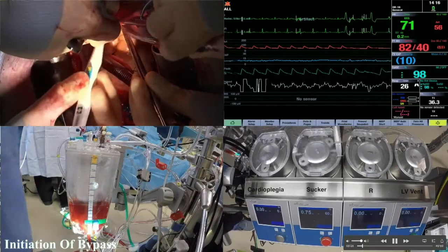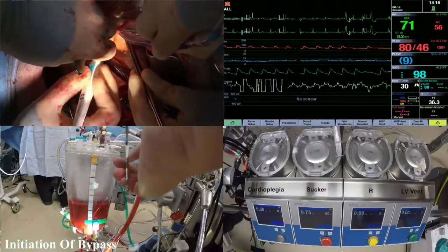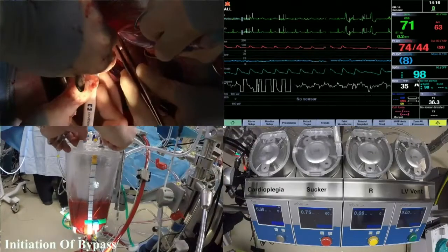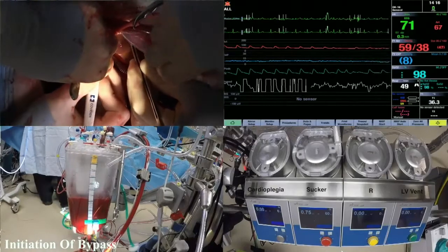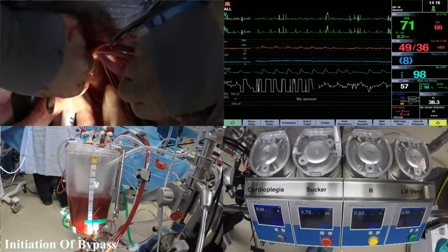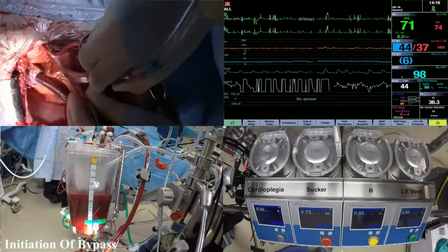I haven't seen a right atrial appendage like that in a long time, Joe. Really, I know. It's exciting. Beautiful. Easy to fix if there's a hole in it. Yes. Oh, here, look. We're going on pump. Oh, there you go. Reservoir getting filled up. There you go, Mr. B.